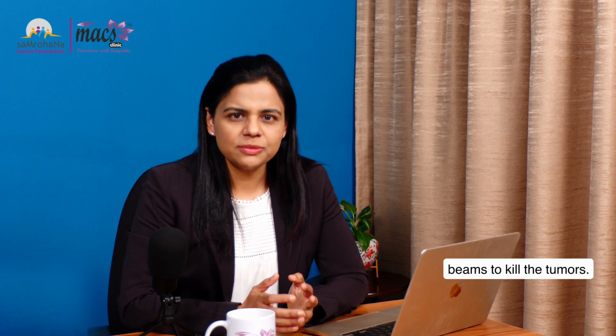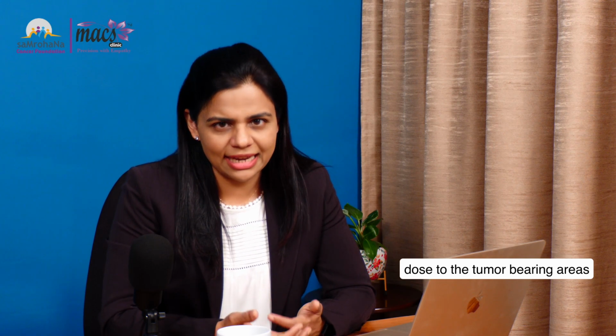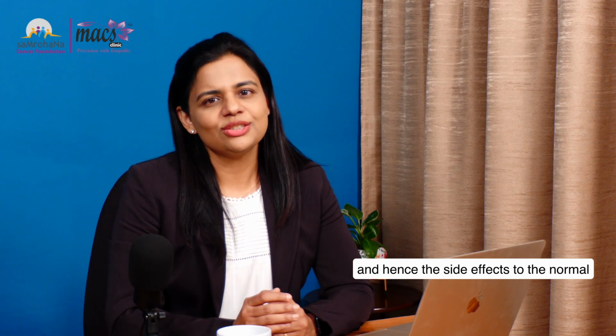Radiation therapy is the use of high energy X-ray beams to kill the tumors. The challenge is that tumor bearing areas are never isolated in watertight compartments. Tumors originate from and coexist with your normal organs. The basic philosophy of radiation therapy is to maximize the radiation dose to the tumor bearing areas and minimize as much as possible the dose, and hence the side effects, to the normal organs in the vicinity.